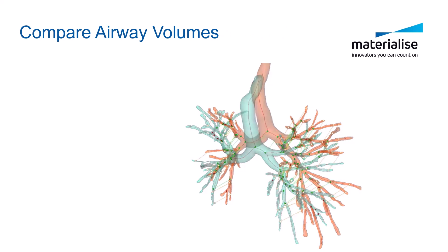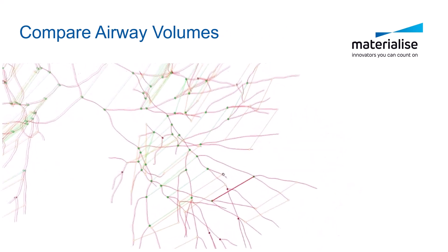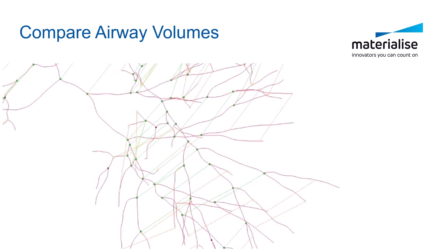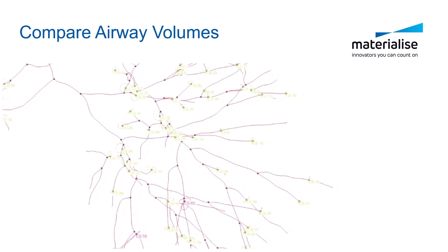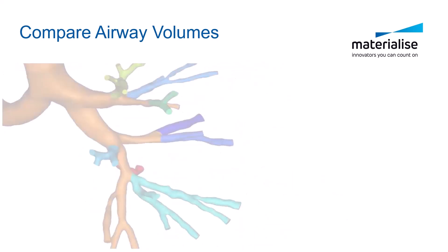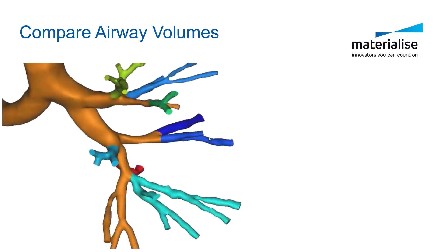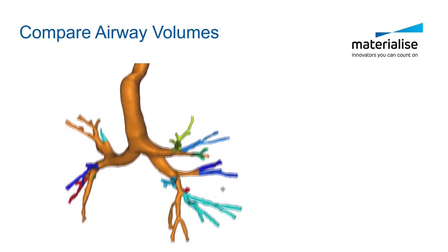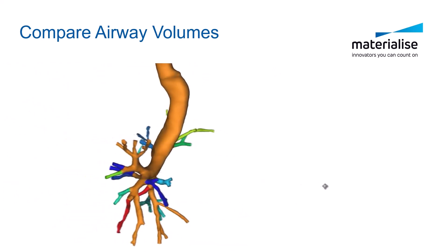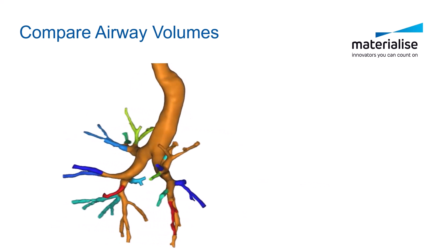Compare pre and post-op or patient 1 versus patient 2 using the airway centerline matching to compare volumes at B-level. Fine-tune matching results and make the airway topology consistent. Fine-tune the cutting planes and the comparison will show up as a heat map of the smallest and greatest differences.